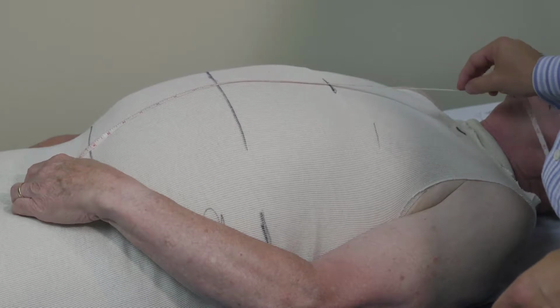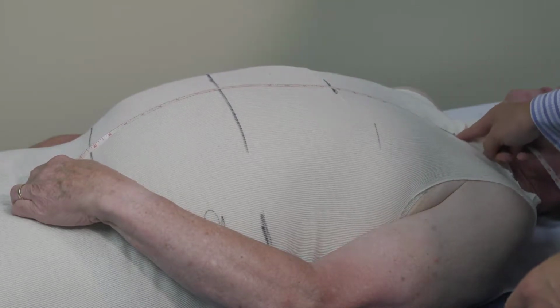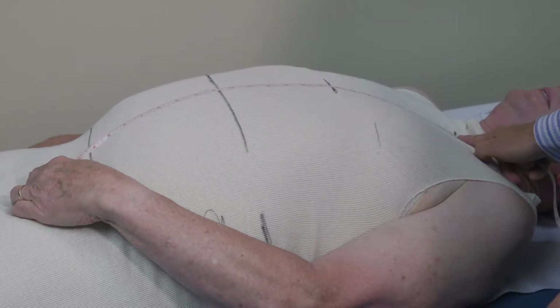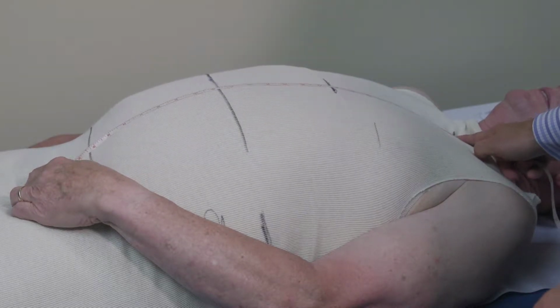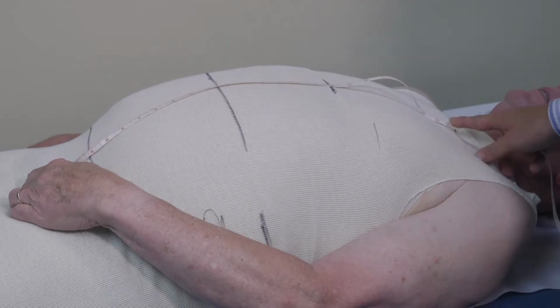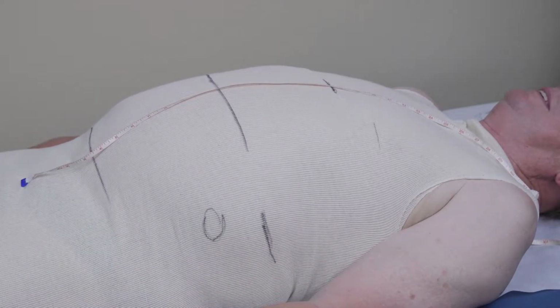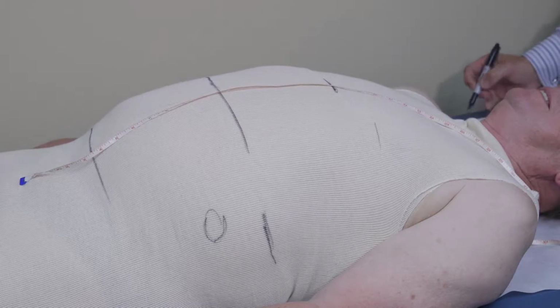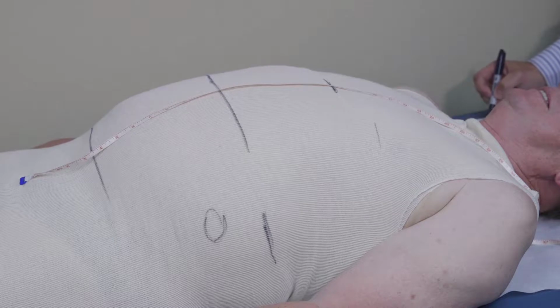Now we're going to go all the way up. And wow. Okay, so when he is supine, sternal notch to the symphysis pubis is 26.5, which is already more than it was in standing, but we'll go over that in a minute.